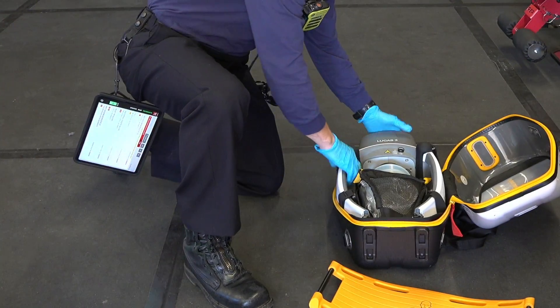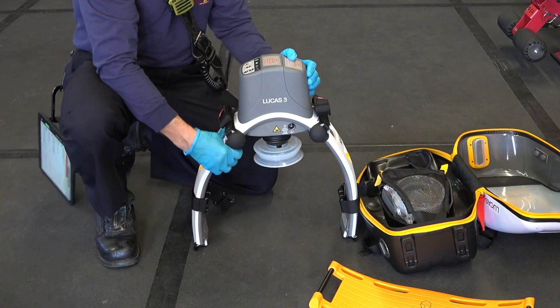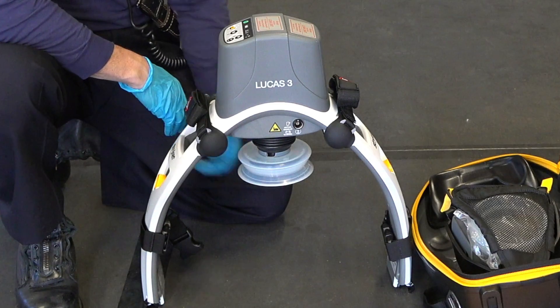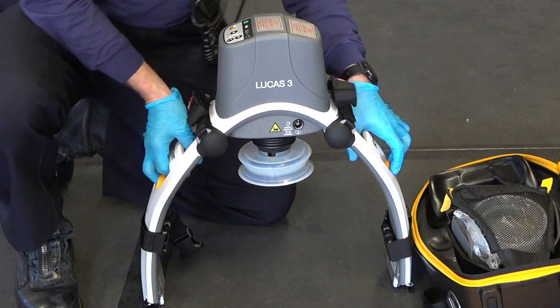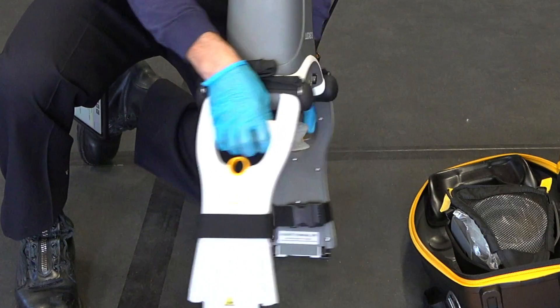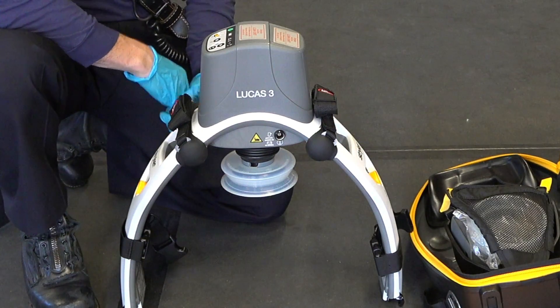Let's talk about the actual Lucas device. As it comes out, you'll see the working parts on top — all the knobs are on top. You'll notice the suction cup underneath, and then on both sides, just these yellow loops. These yellow loops are used as triggers to attach the device, and when the device is attached properly, it will actually make a loud click, and you'll hear it click into place.